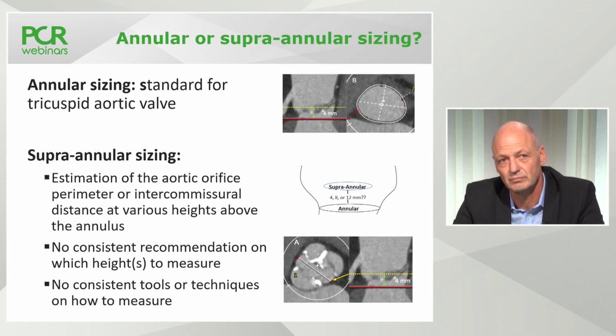Okay, and just to come back to the 4 millimeters point, because I think that derives from the shape of the valve being a bit like the shape of a volcano. And 4 millimeters is an important point for some anatomical reason. Can you just clarify that for us?